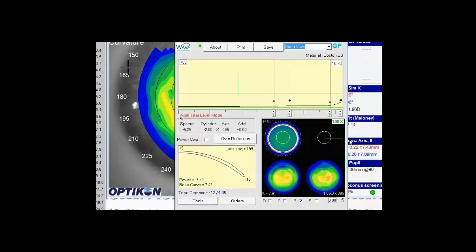Now let's say for example we put the lens on and it's too flat overall. We want to tighten up the entire lens. Easiest way to do that is to click down or drag down each dot. So the red dot, if I drag it down, is going to adjust the central base curve. So you'll notice currently the curvature is a 747. If I drag it down, change it to a 742.